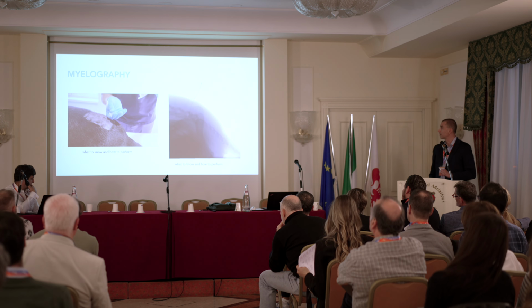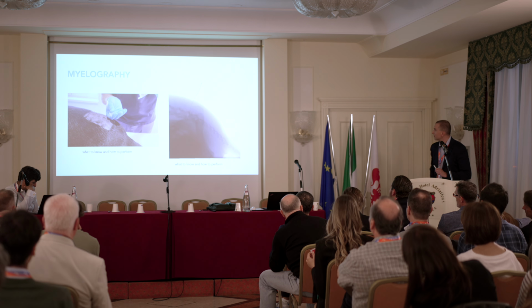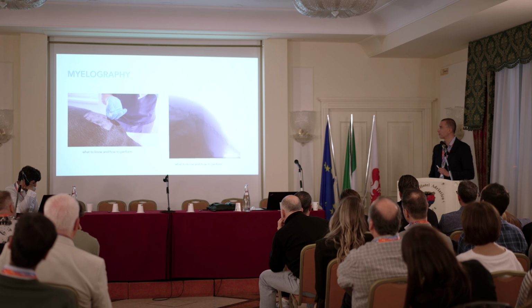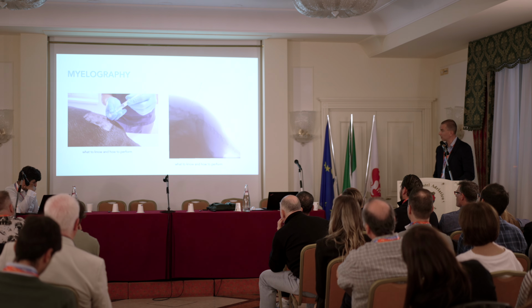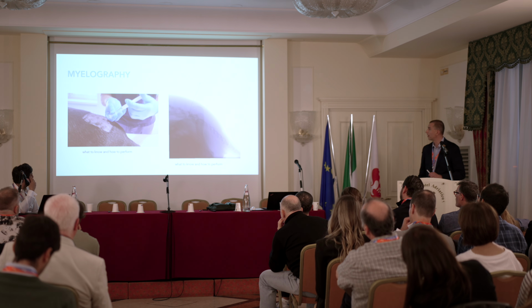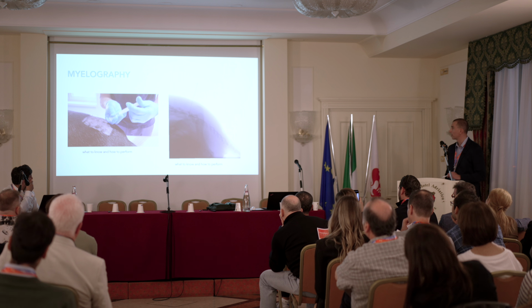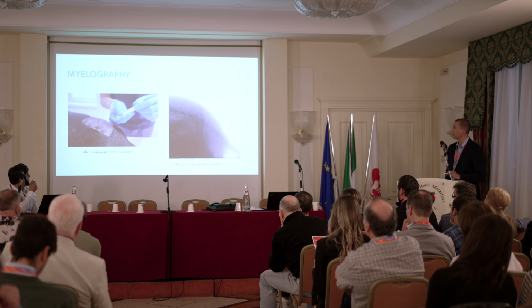So, I just want to be as interactive as I could. So I perform fluoro during application. So you can see how it is looking on the fluoro during application of the contrast medium to this dog. You can see on the right picture how the myelo is going.